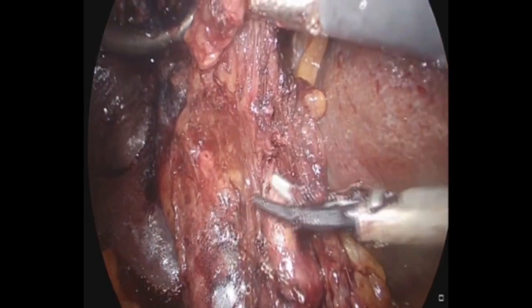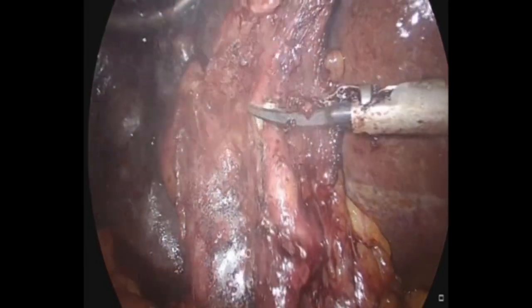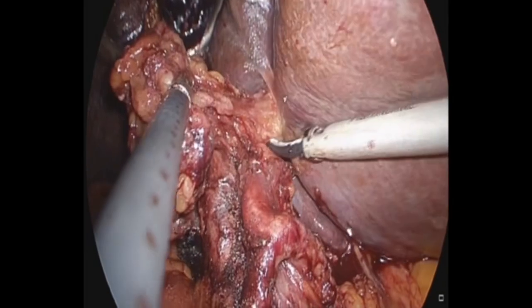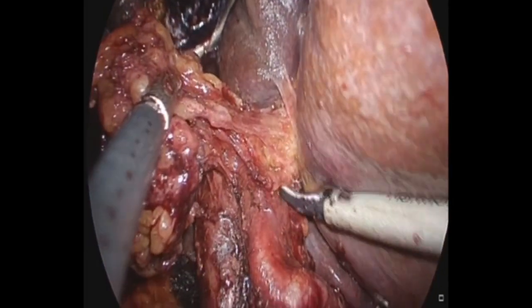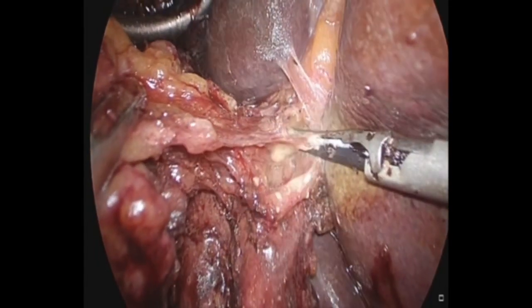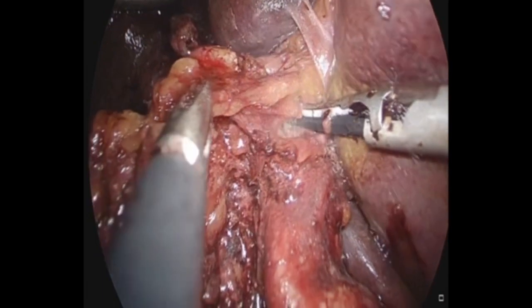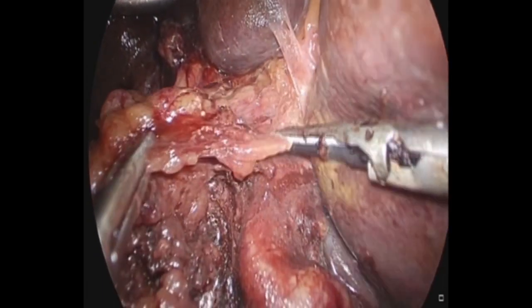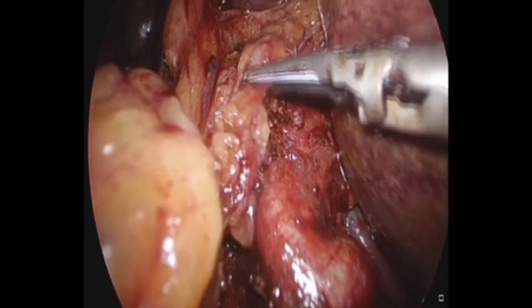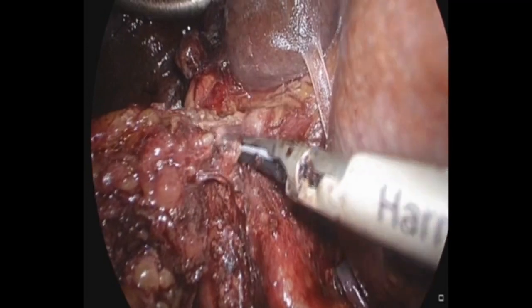For example, in this situation, we are working close to the gastroduodenal artery and common hepatic artery, further going up into the hepatic artery proper. The trick is to remain close to the tunica adventitia. When reaching the hilar plate, one should be very careful not to cause any injury to the left or right hepatic artery. All the fibro-fatty tissue is dissected off the artery.